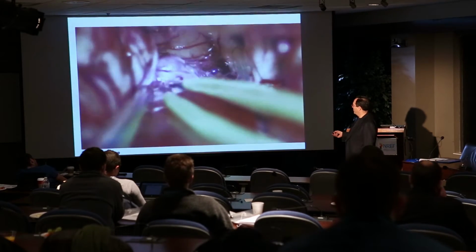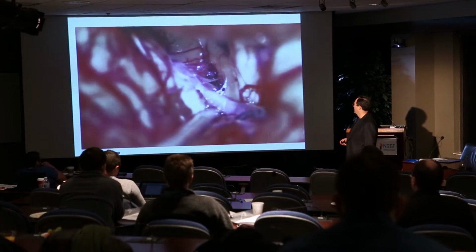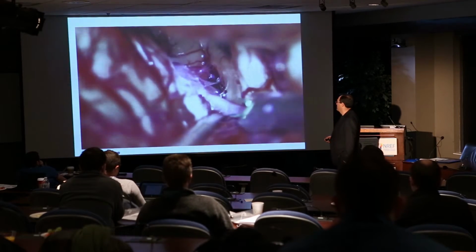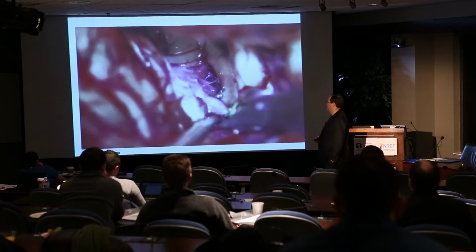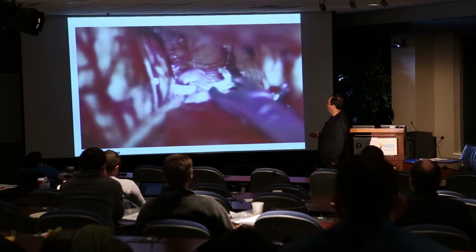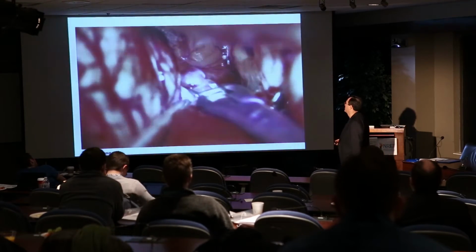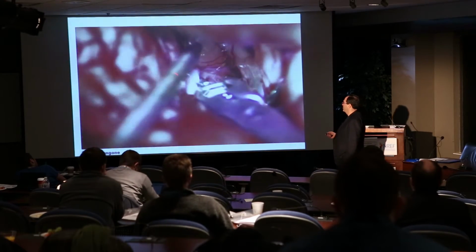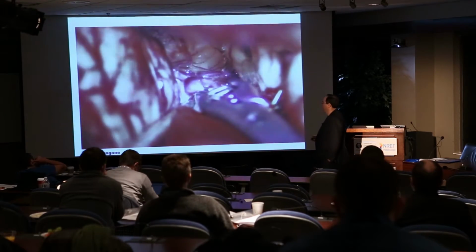This is just sort of looking underneath. Seems like it's a little out of focus. Putting a little temporary clip. And then clipping the aneurysm with a slightly curved clip. That original position, again, doesn't completely obliterate it, and I think we just adjust that a little bit.